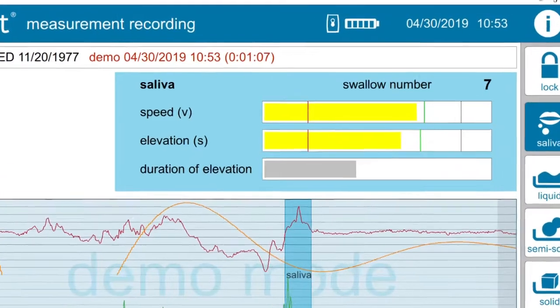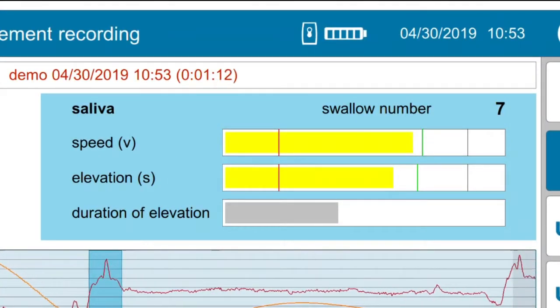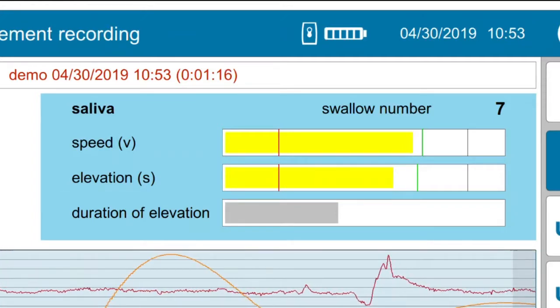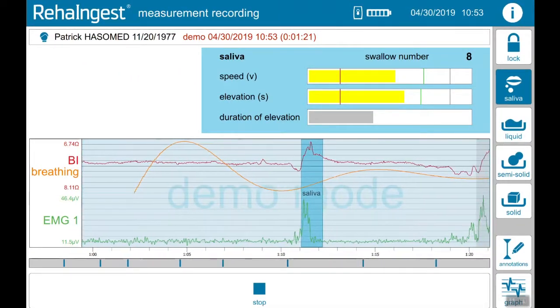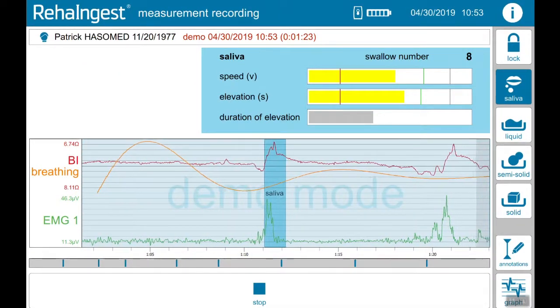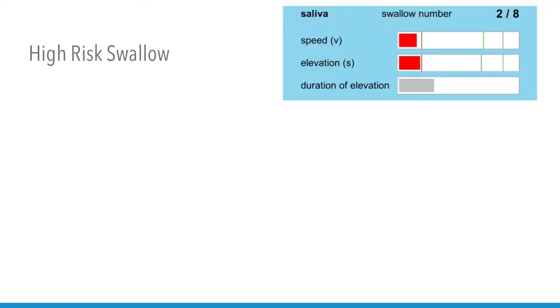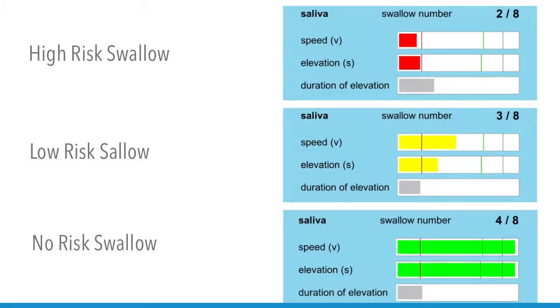A swallow will be highlighted in blue for faster identification. Every single swallow is evaluated on elevation speed, maximum elevation, and duration of the elevation to the maximum of laryngeal movement. ReaIngest gives a specific range: not at all like a healthy swallow, colored in red; partly like a healthy swallow, colored in yellow; or just like a good healthy swallow, colored in green.